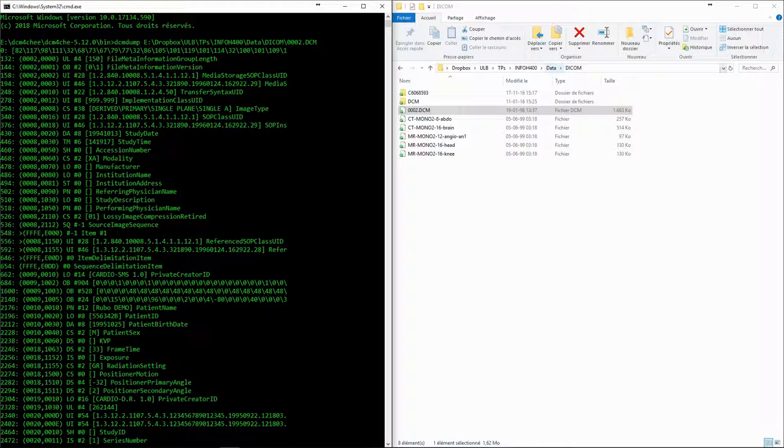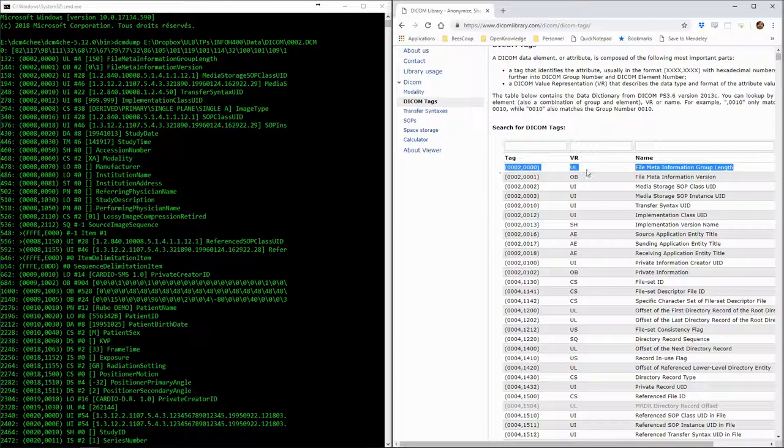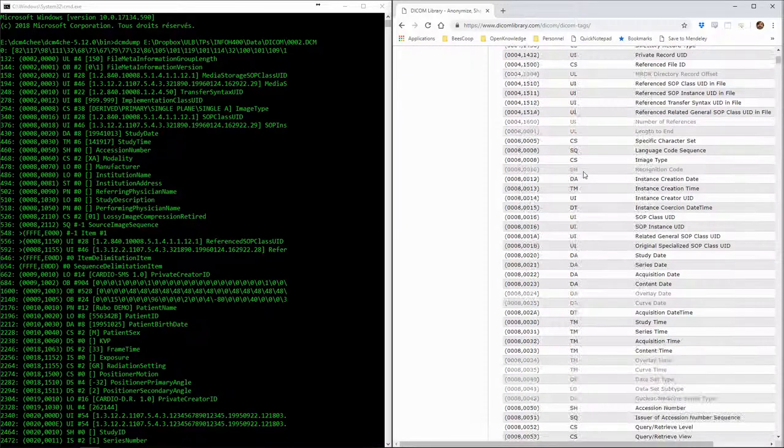In this case, 0002-0000 corresponds to the file meta-information group length. After that, we can see the type, UL, and the length, 4. We can always use the DICOM documentation to check the value representation and the name of the tags.